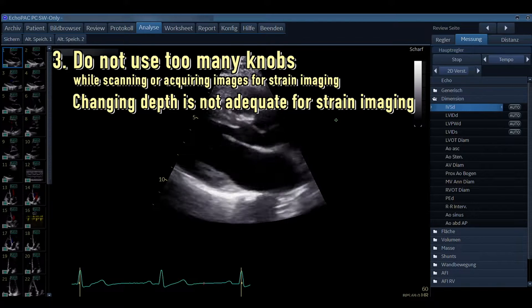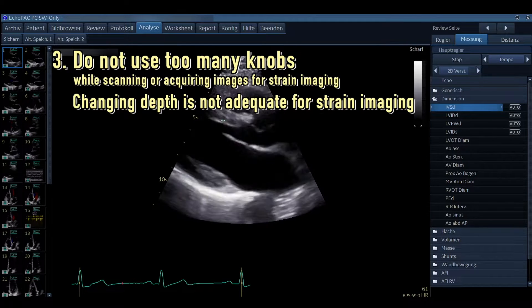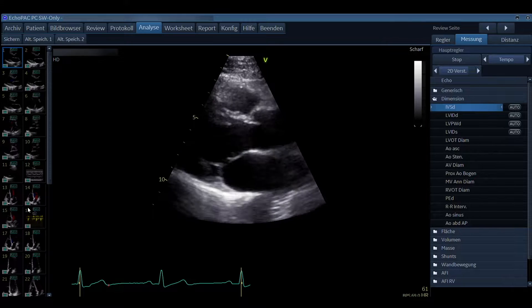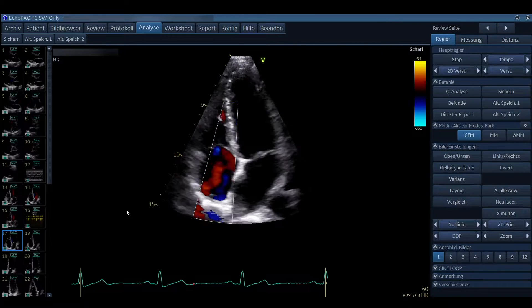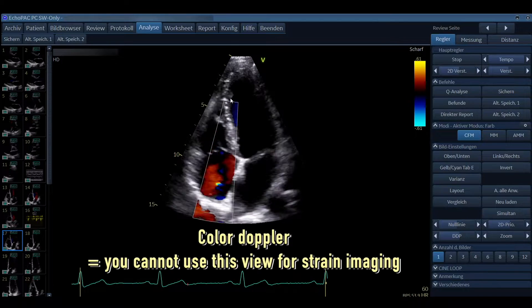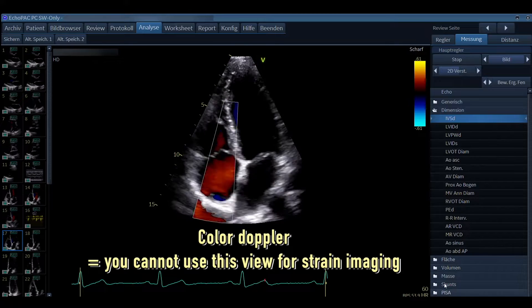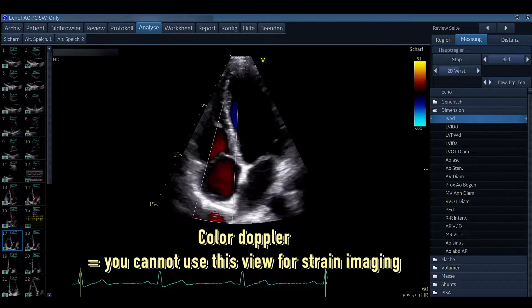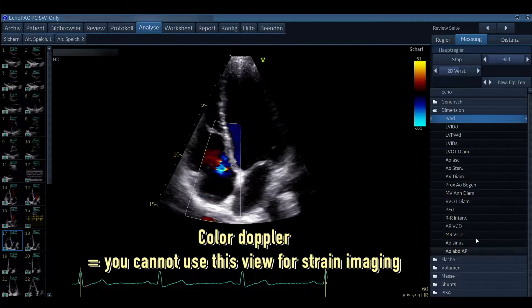This is very important to notice, because when you change the width of the sector or the depth in views you need for strain imaging, you cannot perform strain imaging. Here is another example where color Doppler has been added — color Doppler is also a geometry change, so these views cannot be used for strain imaging either. If you add color Doppler, keep in mind you cannot use it for strain imaging; you won't even see the option.